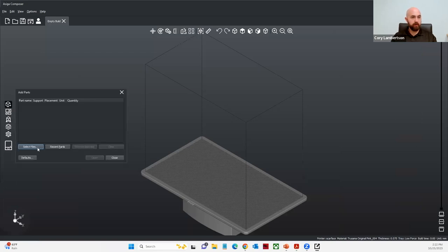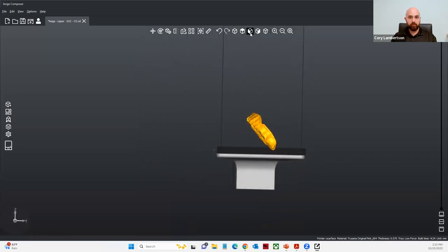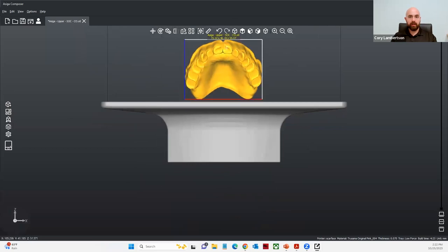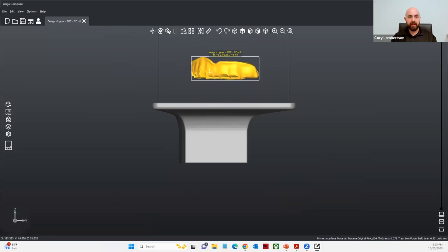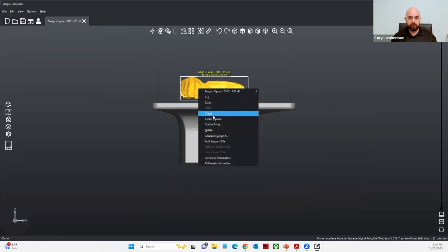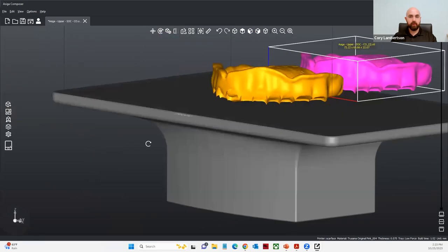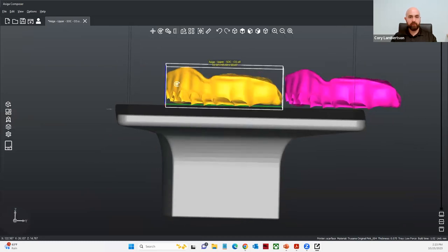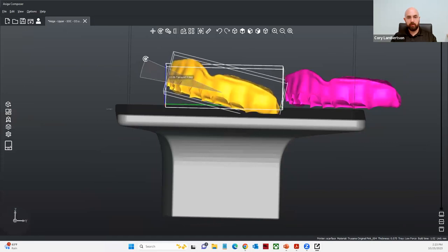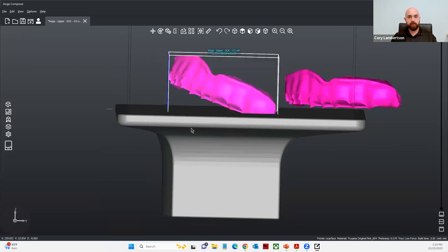Let's go ahead and import some dentures. I have a singular denture that I'm going to print. I'll select open to import my denture base. We're going to do this two ways — how the IFU states, and then I'll also place it on about an 80-degree inclination. In the instructions for use, it states to place this horizontal to the build platform and then at a 20-degree angle, so if I just right-click and move my mouse, I can rotate it to a 20-degree angle.